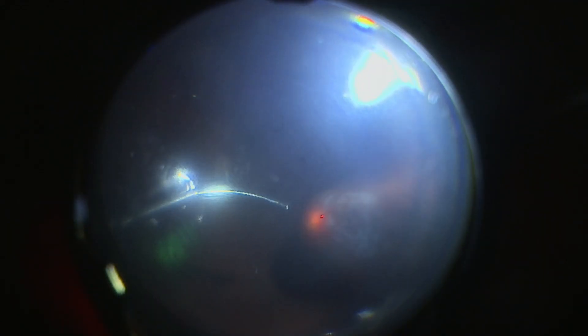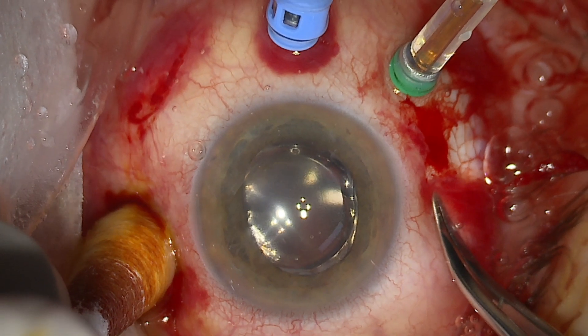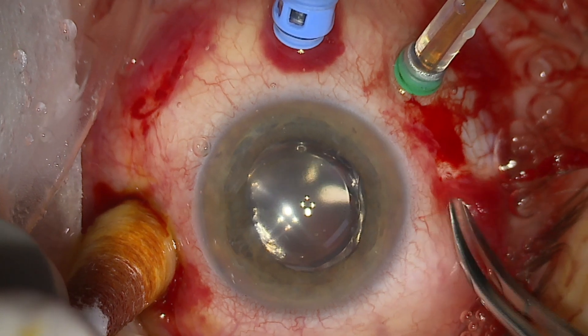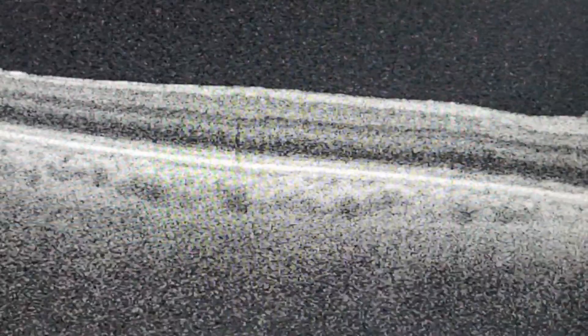Known as low-integrity retinal attachment, improper repositioning may be associated with poorer postoperative visual outcomes. Endolaser is applied to the areas of the superior breaks, and the surgeon completes the surgery with a non-expansive concentration of C3F8 injection.